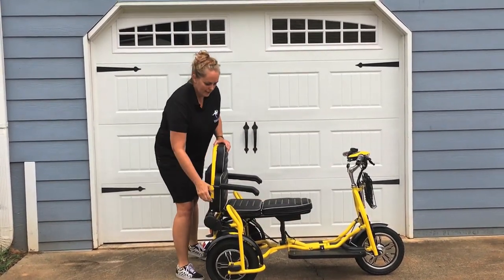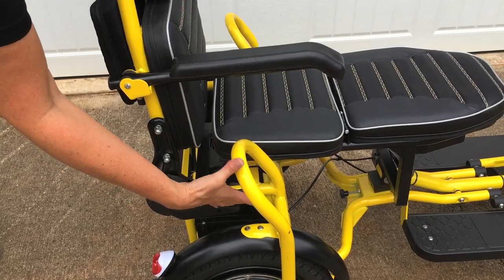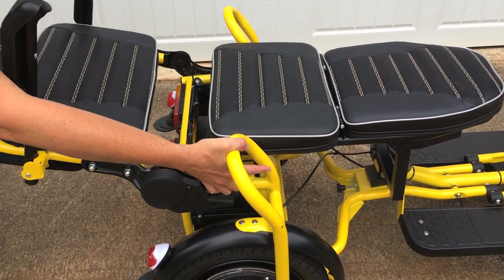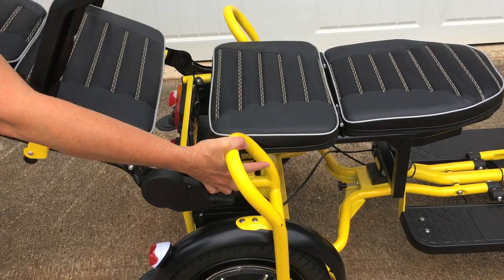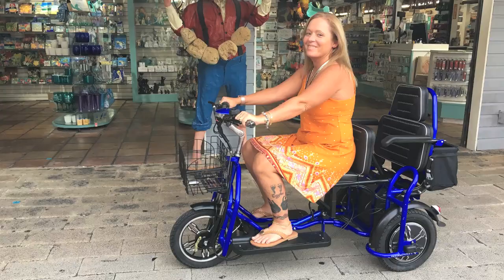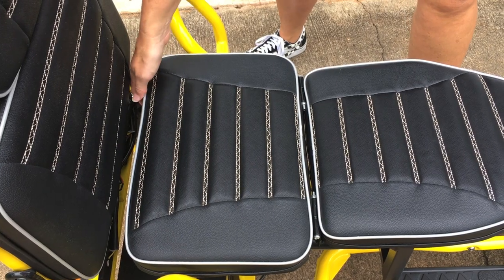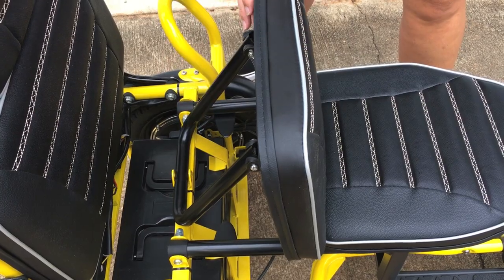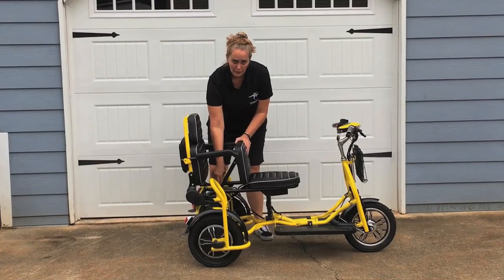Your seat back here — there is a lever that you can pull up and adjust the backing of the seat so you can go all the way into a flat position. If you're riding by yourself and would like more lumbar support, you just lift up on the seat and put the bar in the little bracket back here.